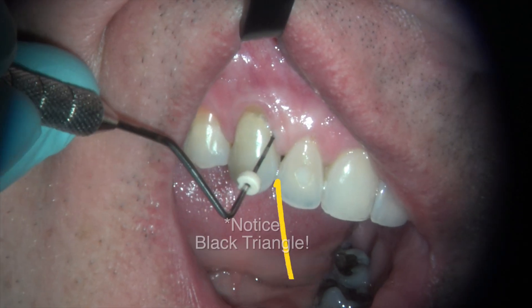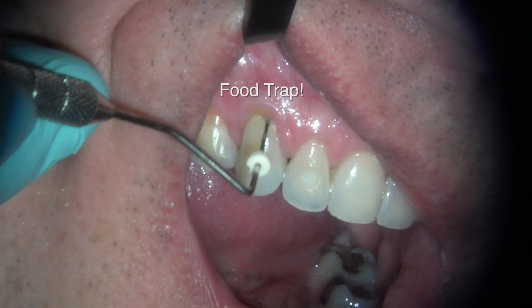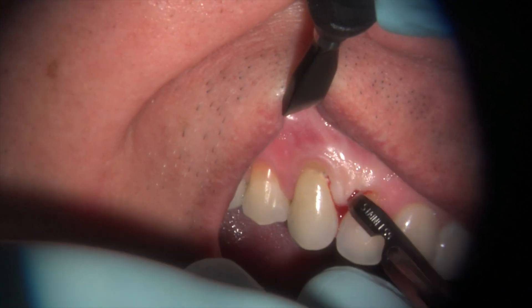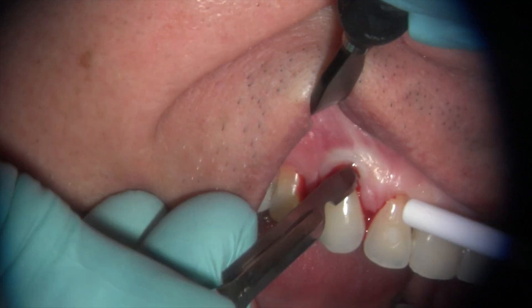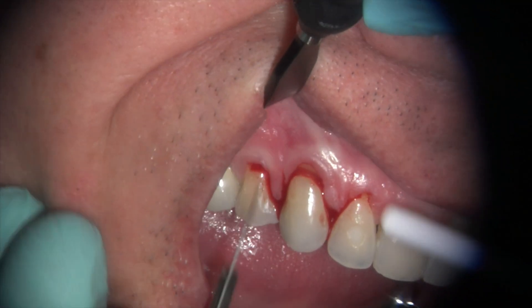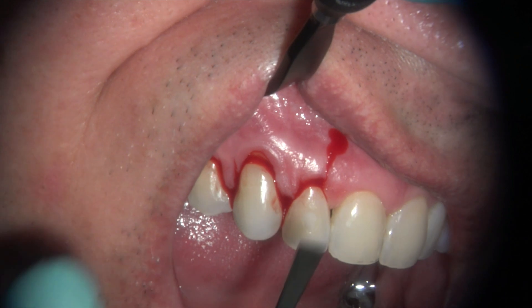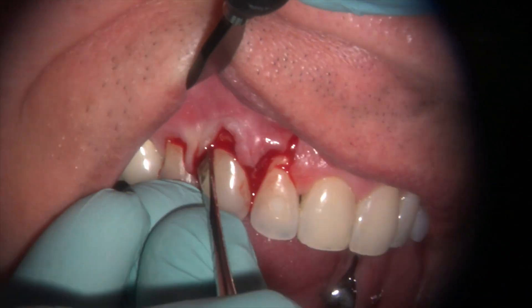Putty is placed right around the area of the resorptive defect following hydraulic condensation apical to that. We don't proceed to surgery immediately because we have to let the putty material set — we waited about a week before reflecting a flap. We do a very small flap since we don't need to reach the apex; this is merely an intrasulcular flap to address the gingival area.